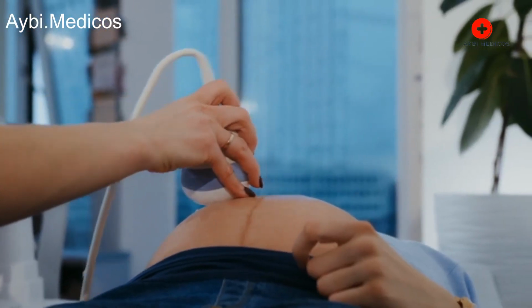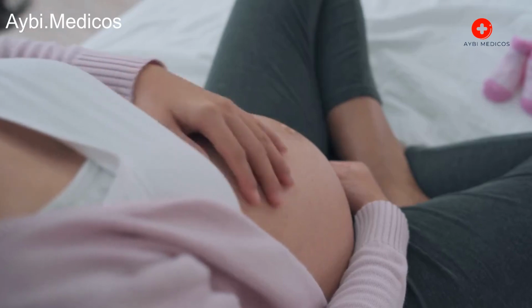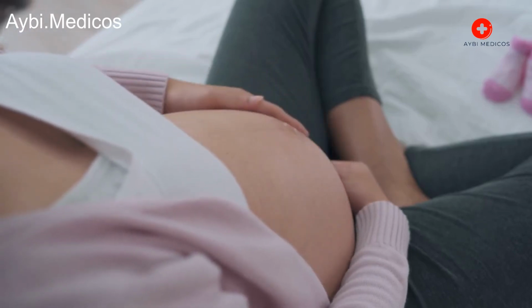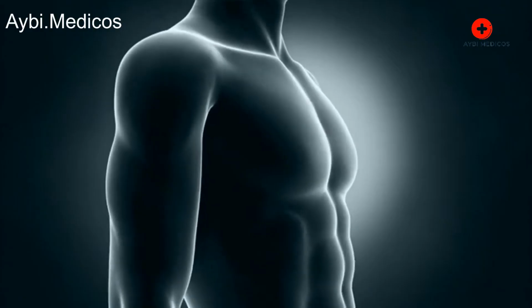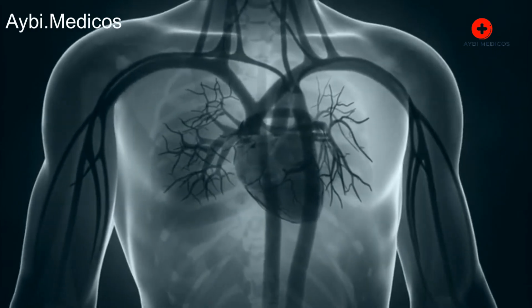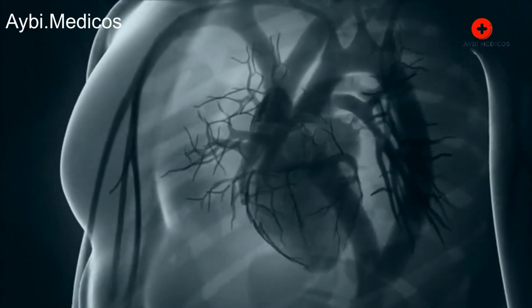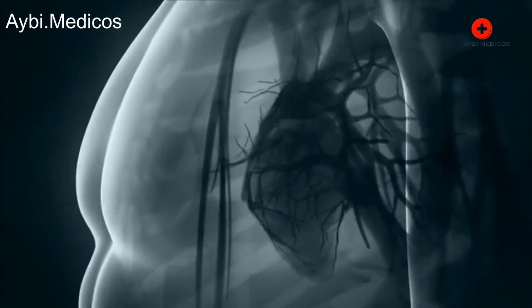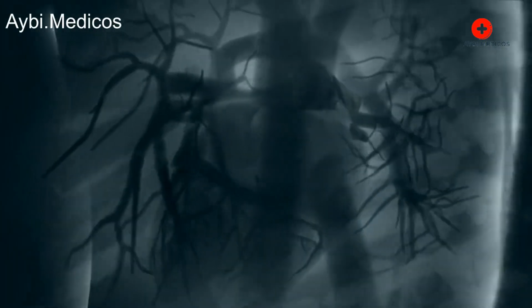Applications of ultrasound. Obstetrics and gynecology. Ultrasound is widely used to monitor fetal development during pregnancy, assess the health of the uterus and ovaries, and detect potential issues. Cardiology. Ultrasound helps visualize the heart's structure and function, including the chambers, valves, and blood flow patterns. It is used to diagnose conditions like heart valve disorders, cardiomyopathies, and congenital heart defects.